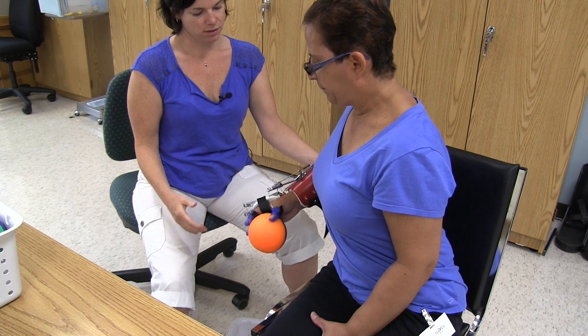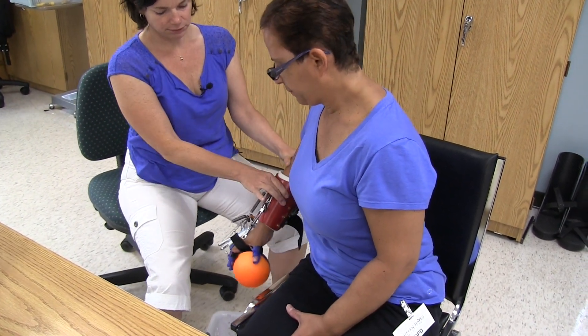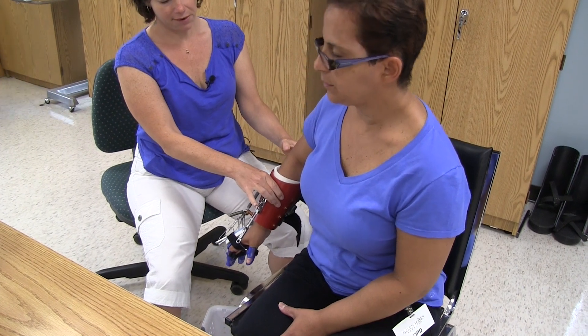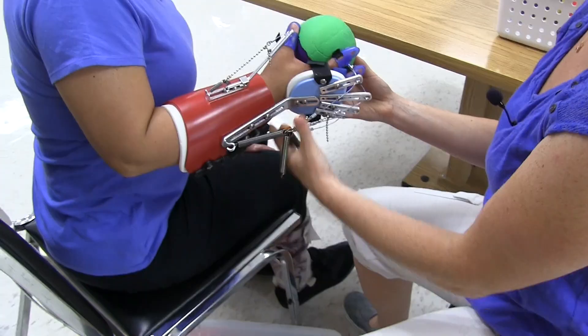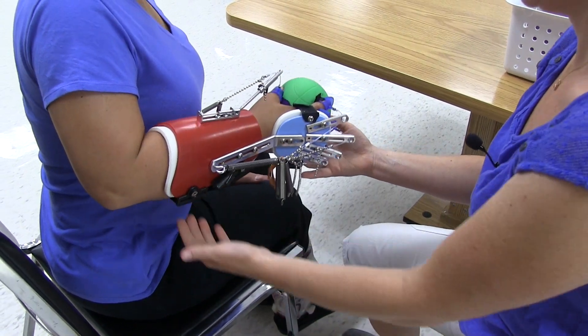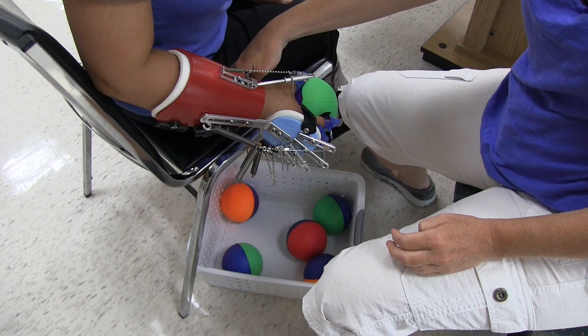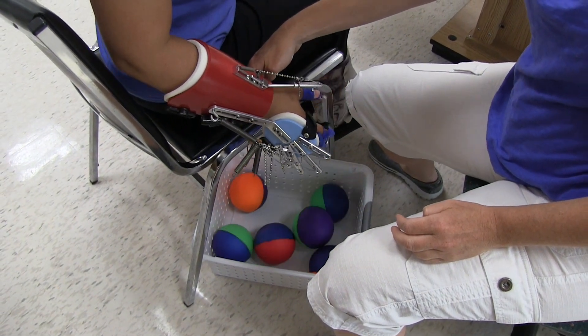Try to relax your mouth, elbow down. Squeeze, squeeze, squeeze. Good, bring it down, relax. Perfect.